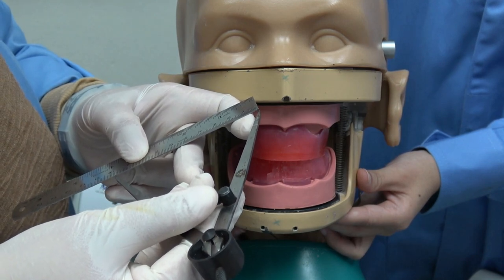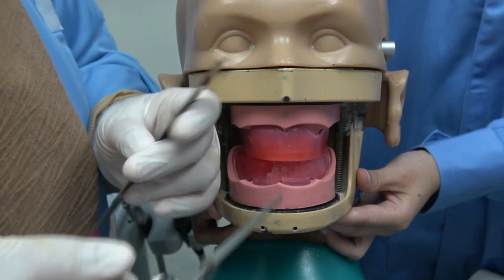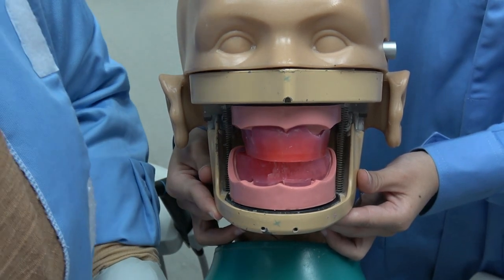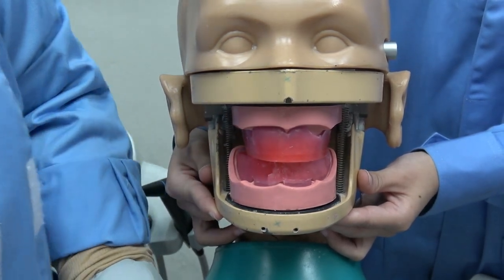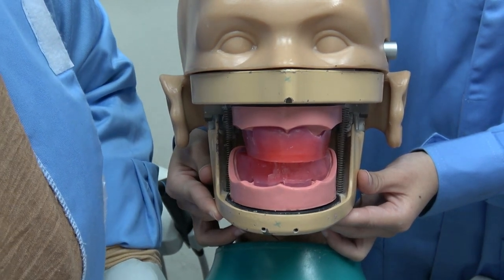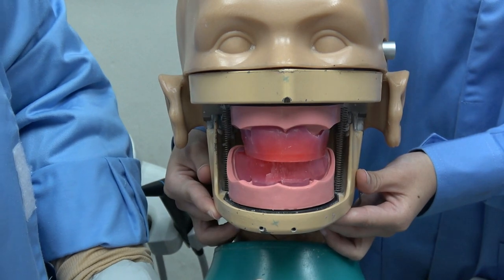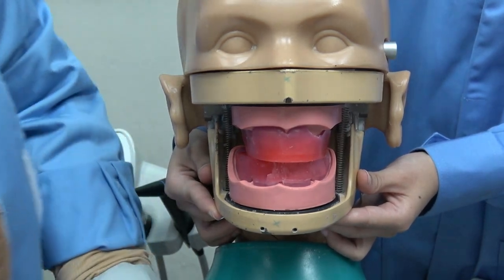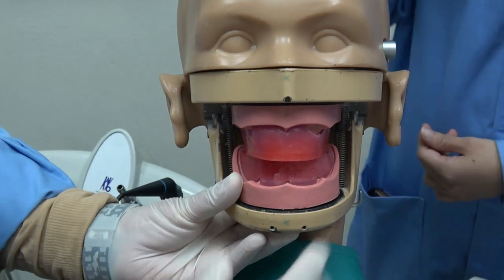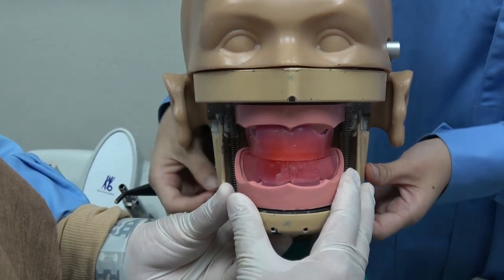Okay, it's now 98. Alright, so 100. Before this we got the RVD is 100. Now our OVD is 98. So we get the freeway space around 2 mm. Okay, so it's sufficient. Then when you get this, now you can mark the lines.